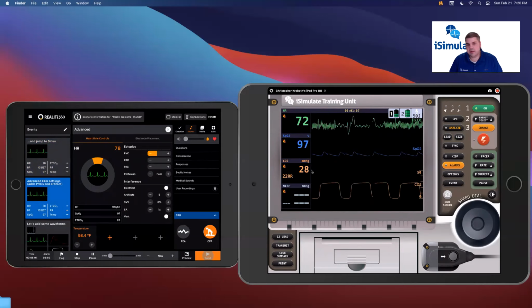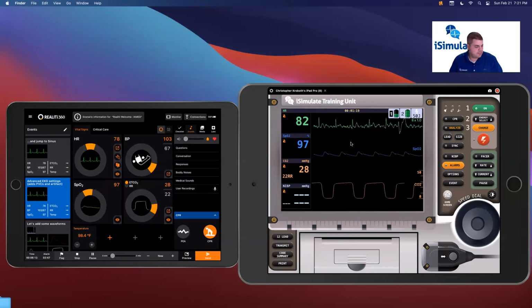I'm from Virginia, so I call 5th degree of artifact VDOT because you get loss of contact, you get baseline sway. You can pick the interstate you're driving on, and it makes it more realistic. So we'll kick these away.